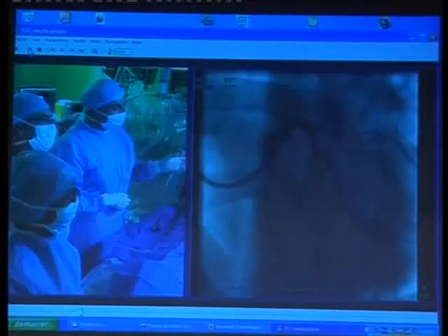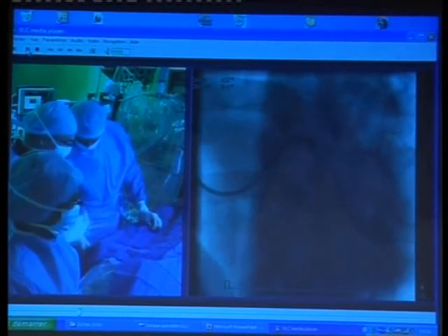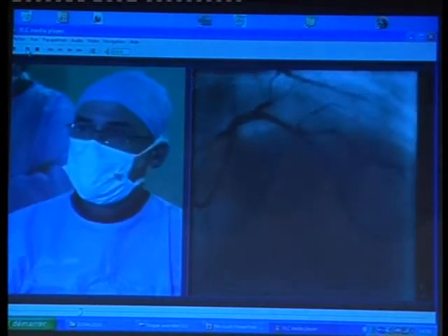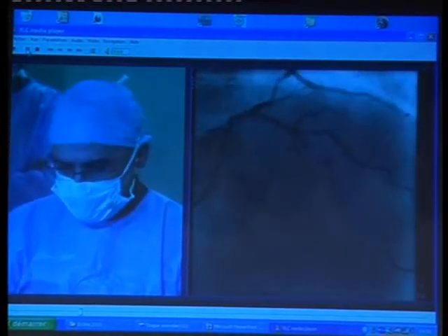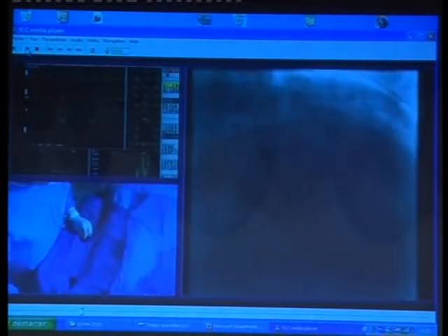Marginal branch, and then it's, I will say, the diagnostic part. So to classify if the marginal branch requires treatment or not, and then see what we have to do for the LAD and even on the diagonal. Yeah, the LAD diagonal is a very interesting lesion. John, can you just freeze it here? Can you freeze to treat the LAD, the diagonal and the left circumflex?